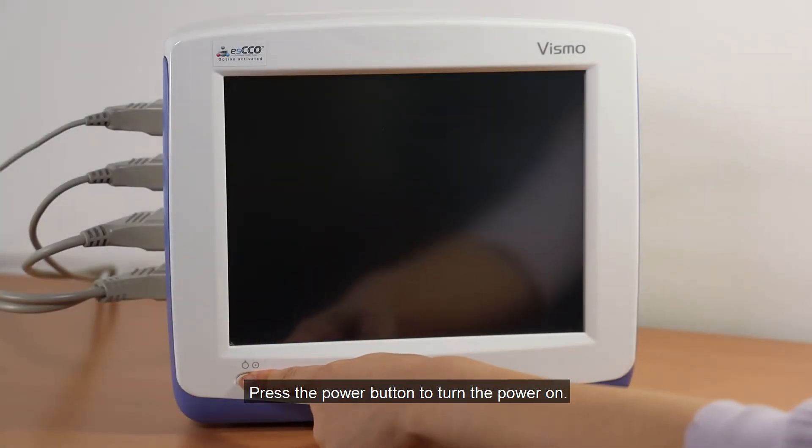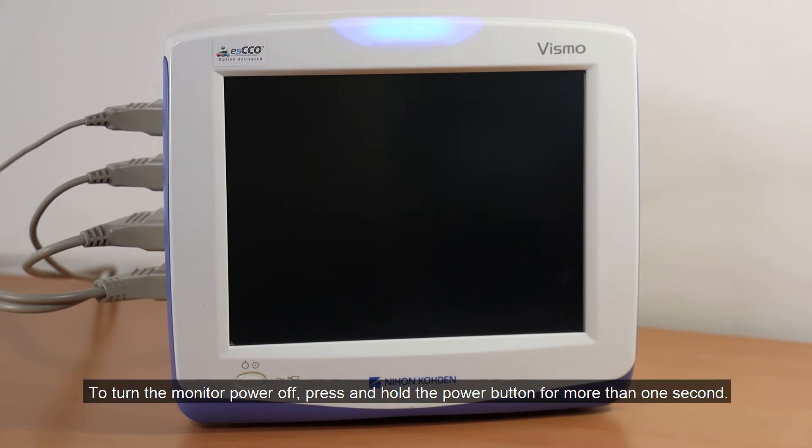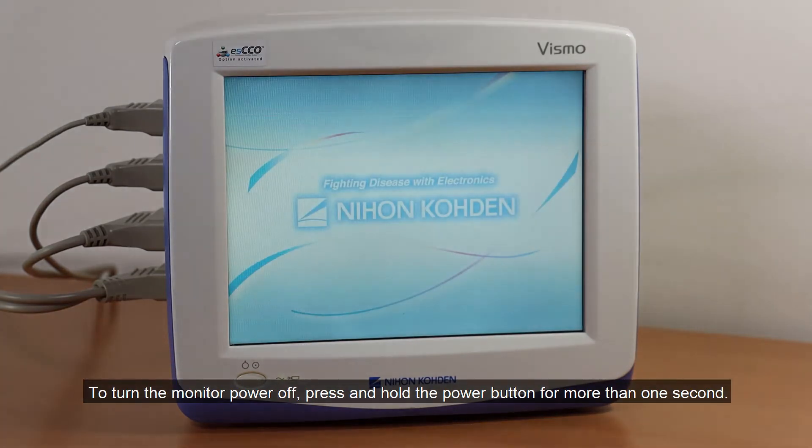Press the power button to turn the power on. To turn the monitor power off, press and hold the power button for more than one second.